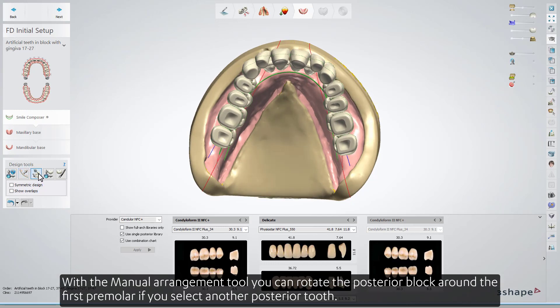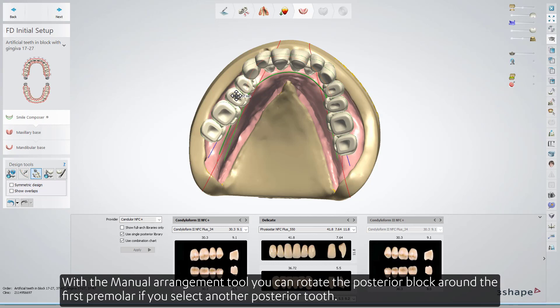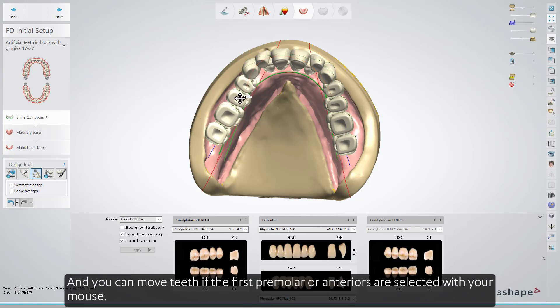With the Manual Arrangement tool, you can rotate the posterior block around the first premolar if you select another posterior tooth, and you can move teeth if the first premolar or anteriors are selected with your mouse.